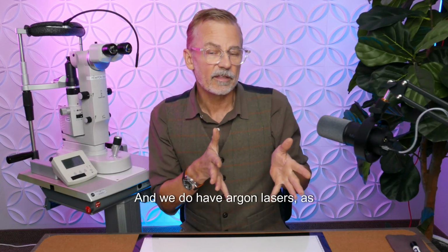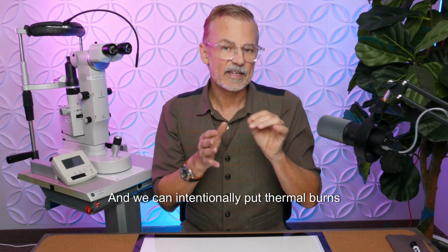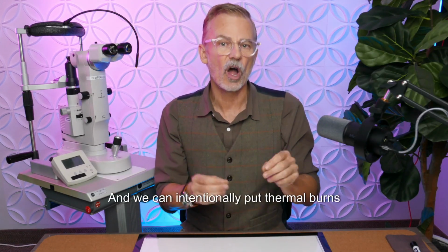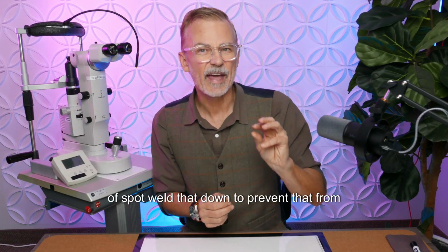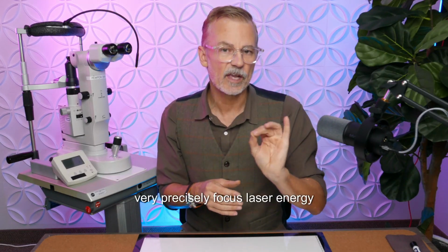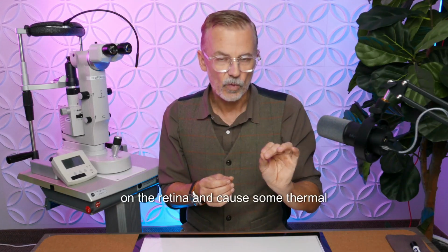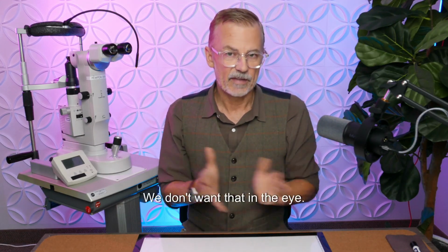And we do have argon lasers, as you know, that will deliver a single beam of light, and we can intentionally put thermal burns on the retina. Why would you want to do that? Well, if someone has a hole or a tear and you need to kind of spot weld that down to prevent that from ever detaching, we will want to very precisely focus laser energy on the retina and cause some thermal damage. That's the intention. We don't want that in the eye.